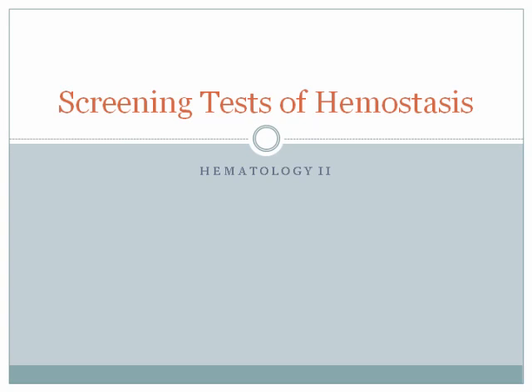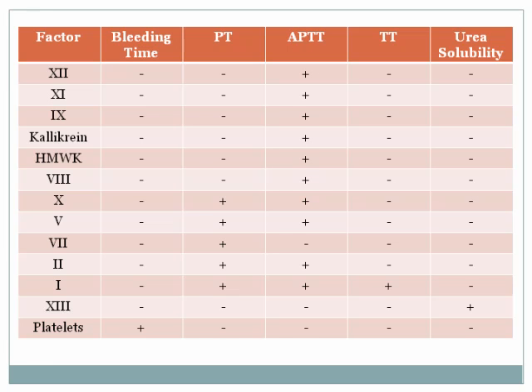All right, so this is our lab PowerPoint screening test of hemostasis. Now that we've talked through all the pathways and the factors, we're going to talk about what tests we run in the lab on coagulation factors. The very first slide here is a nice chart that tells us different tests and what factors are tested in it and which ones aren't. This is a great thing to refer to.